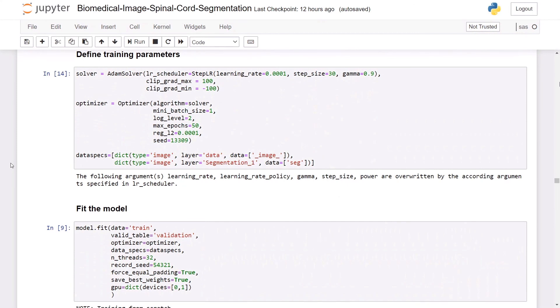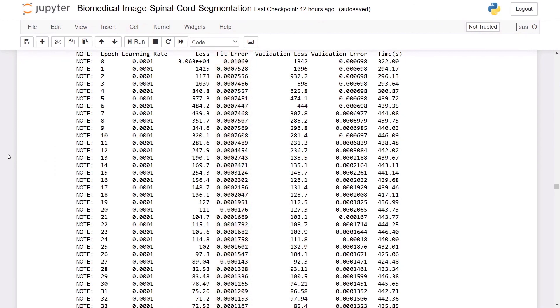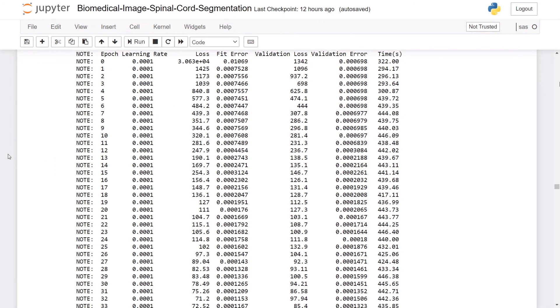Once my model is built and the training parameters are specified, I can move on to training the model. This model trains for 50 epochs. In each epoch, the model looks at every image and creates a guess for those images, then readjusts the model weights based on the guess — that's how it improves the results. Since the fit error is decreasing throughout the training process, the model is getting better and better at predicting where the spinal cord lies within the images. The validation error is also decreasing consistently, letting us know the model isn't overfitting and will provide accurate predictions for images it hasn't seen before.